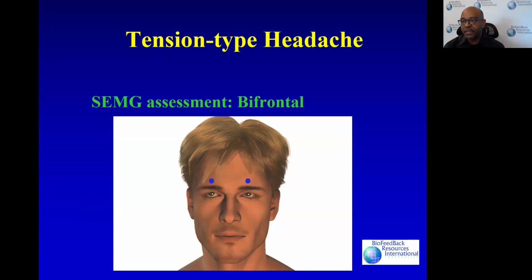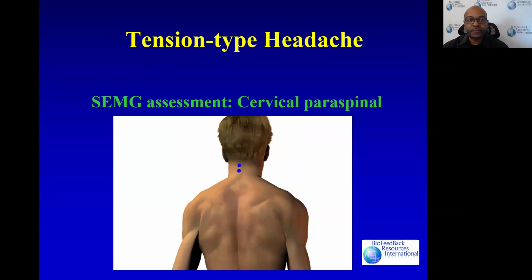You can think about many people that have migraine headaches are now getting Botox injections. And the main thing that that's doing is forcing the muscles to relax or not contract. And so if a person is able to naturally learn how to relax the muscles through the aid of EMG biofeedback, they can get a good result without necessarily having to resort to something like Botox.